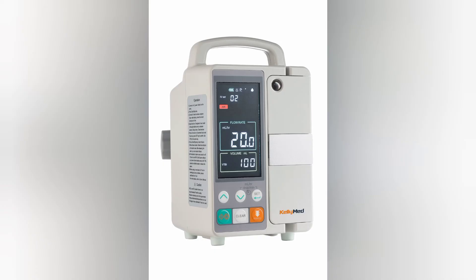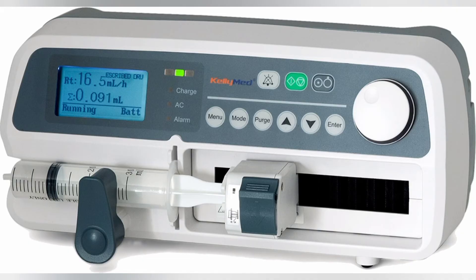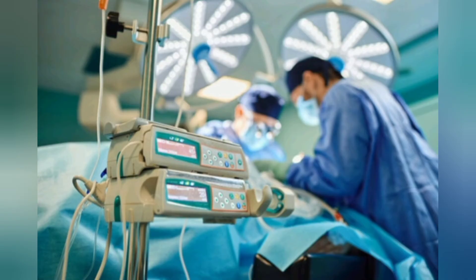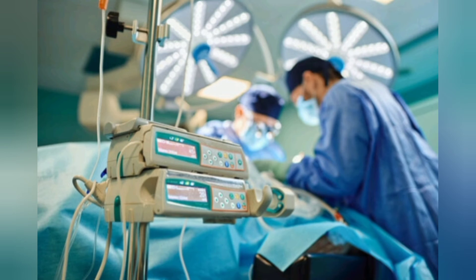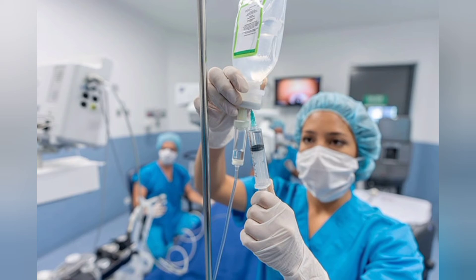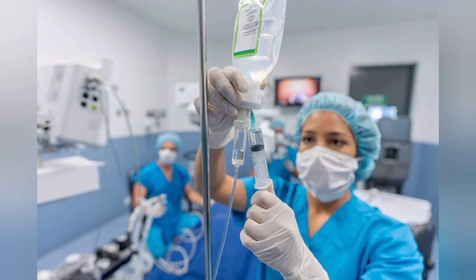The syringe pump and infusion pump are used in some critical cases that may require continuous feeding of medicines during surgery. They are used to deliver fluid medicines according to the required volume. For smaller amounts, a syringe pump is used, and for bigger amounts, a saline infusion pump is used. These devices provide a precise rate and dose of medicine.